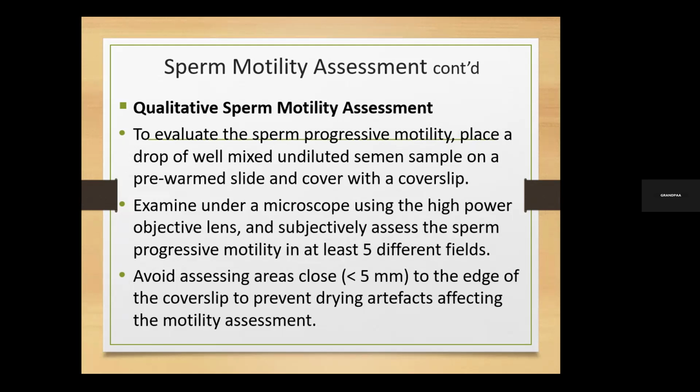Now, you try to avoid looking at the edge of the cover slip. Remember, in the wave motion test, we recommend that you look at the edge. But in that one, you put the drop there and within a matter of a few seconds you are examining it. Here, you apply the cover slip, and you're advised to put the preparation down for about a minute before you examine your slide.